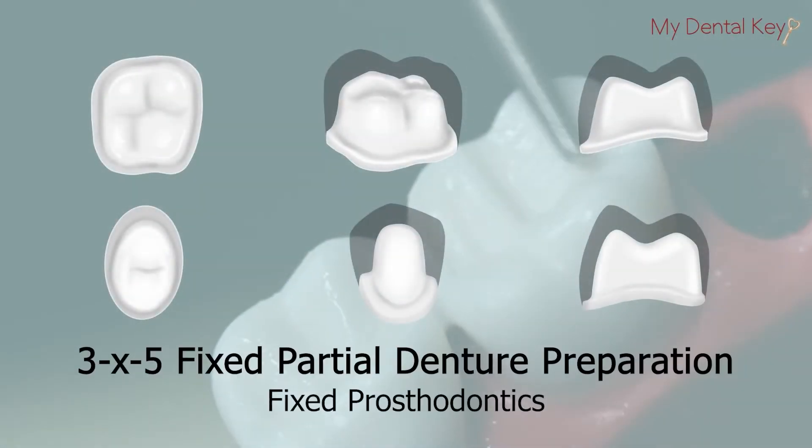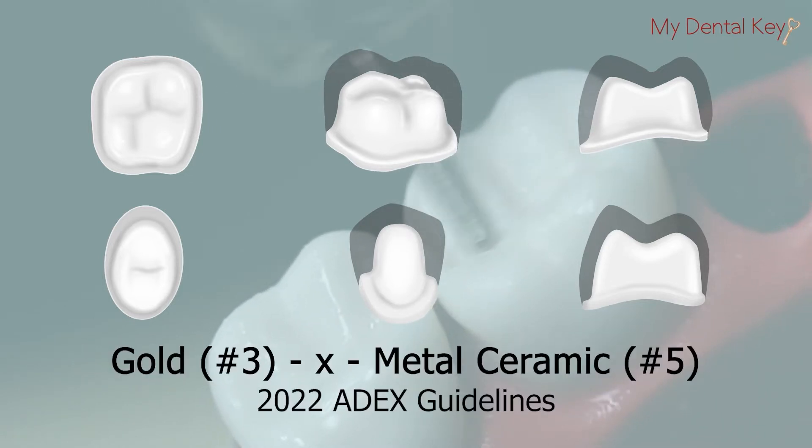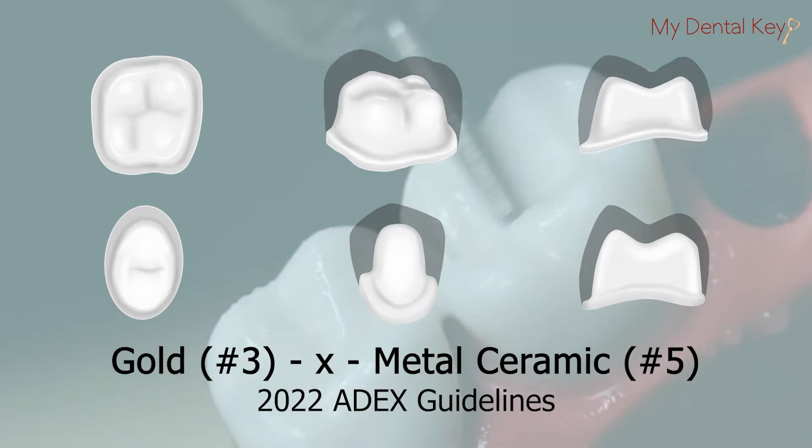This prosthodontics video will cover the 3x5 fixed partial denture preparation. This procedure follows the 2022 ADEX guidelines for the gold 3x metal ceramic 5 preparation for the typodontic exam. This video is intended to help you pass your ADEX exam, but remember to refer to the preparation manual for further clarification.